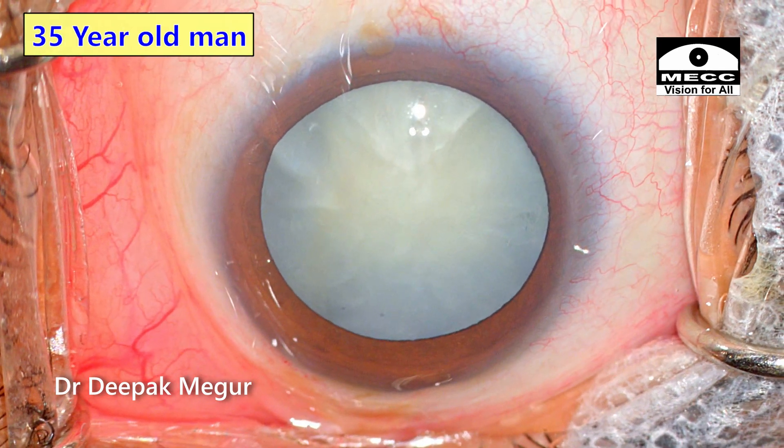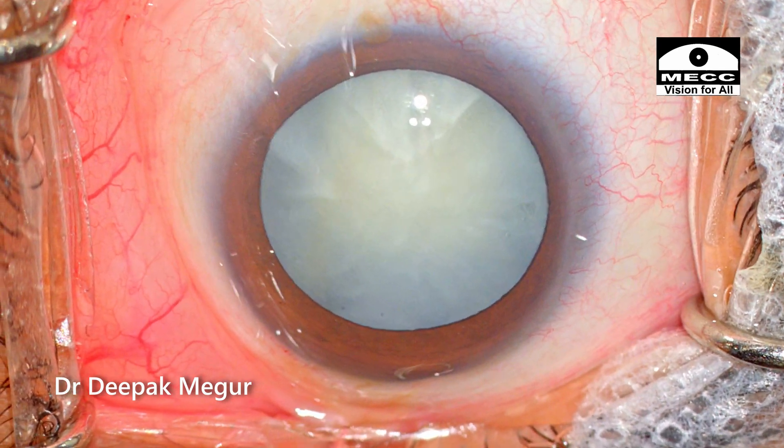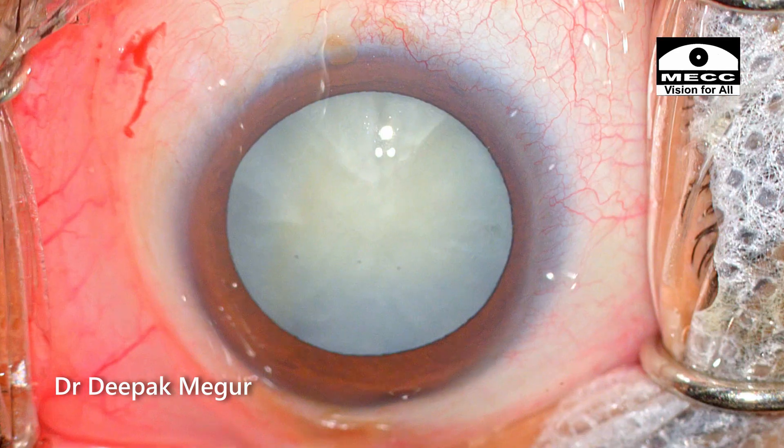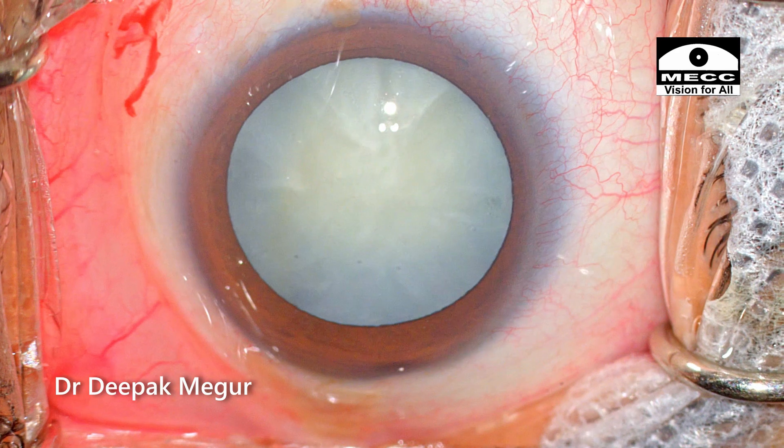This is a 35-year-old male patient who is diabetic for the last 8 years and has an intumescent cataract. The other eye is pseudophakic and is currently enjoying good vision. So let's begin the case.